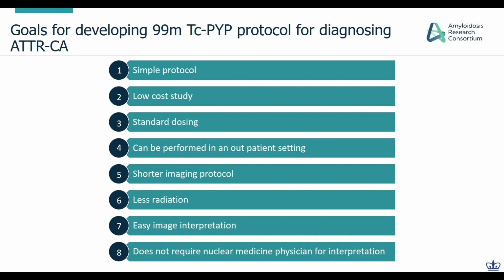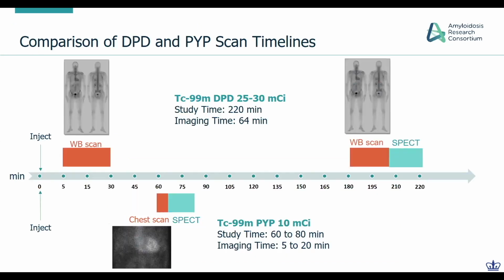And also we did not want the whole body scan, because if you do the whole body scan, then you need a nuclear medicine physician to read that. So for cardiologists, we just wanted the imaging for the heart.